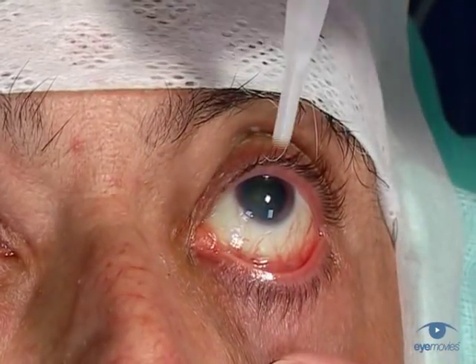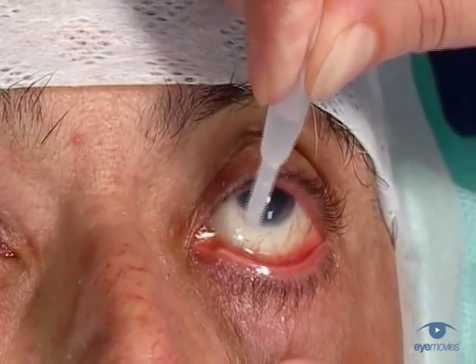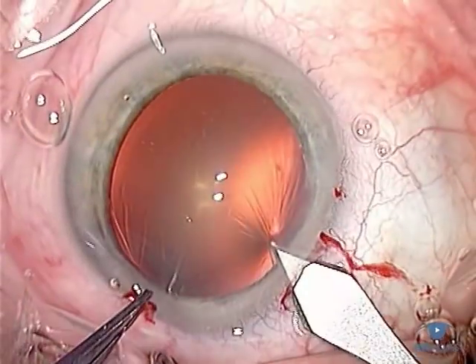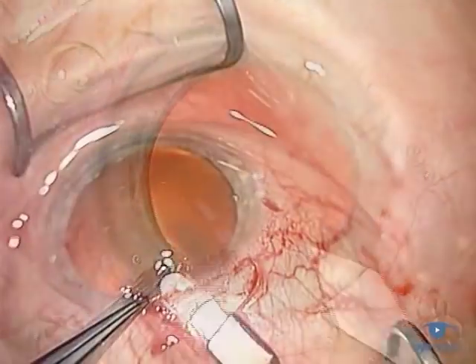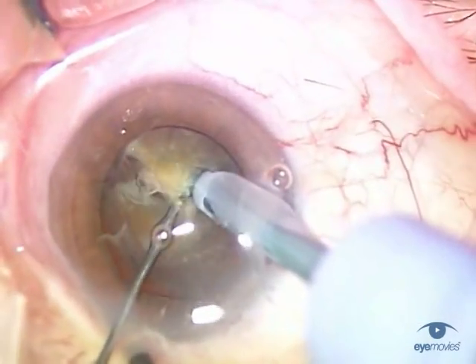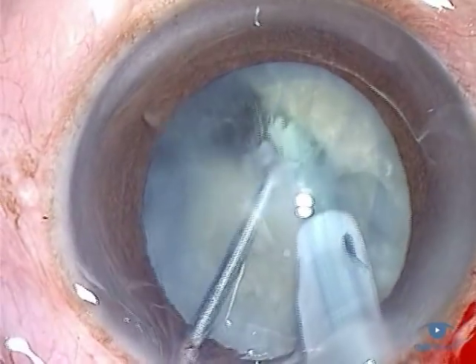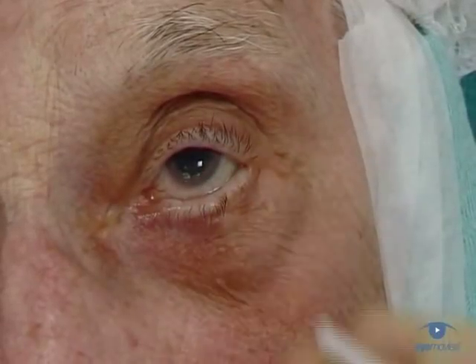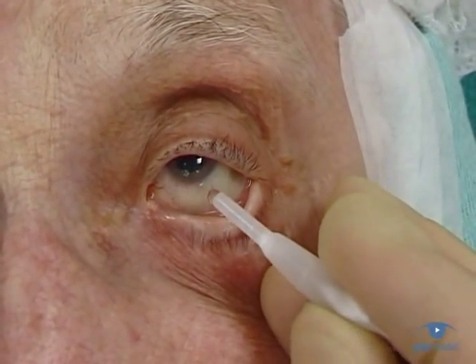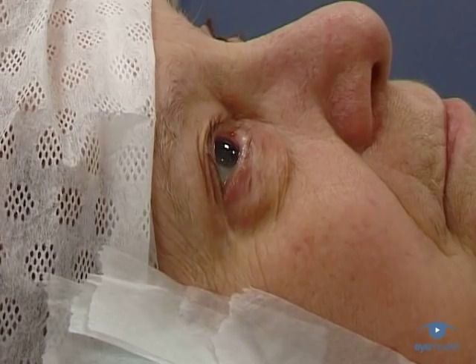Topical anaesthesia can be regarded as the ultimate form of a low-risk, non-invasive technique for phaco anaesthesia. It can be used for all types of phaco incisions, and some surgeons happily use it for all types of cataract. But in the end, it's down to personal choice, and most of us choose to use it selectively. The technique as such couldn't be simpler. And in fact, you've just seen it from start to finish.